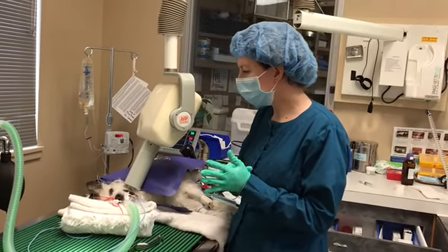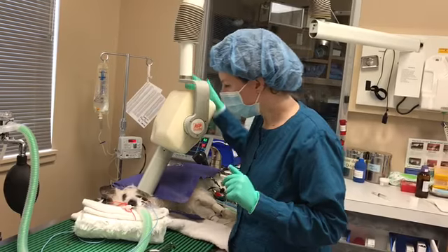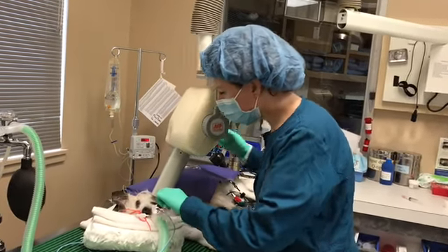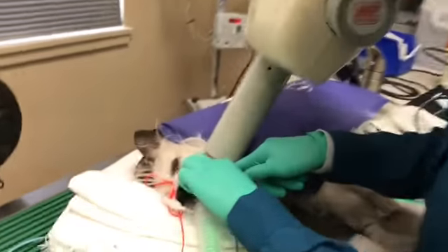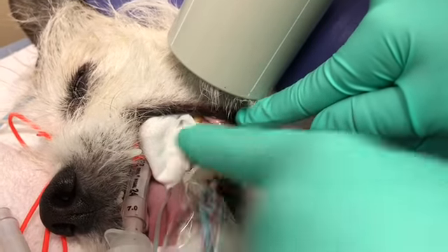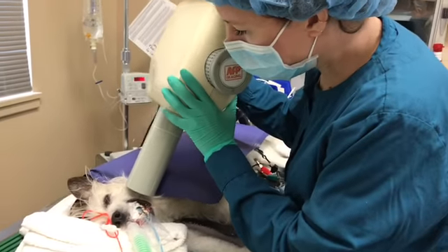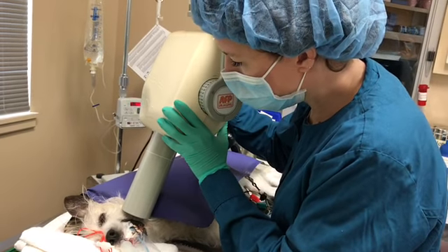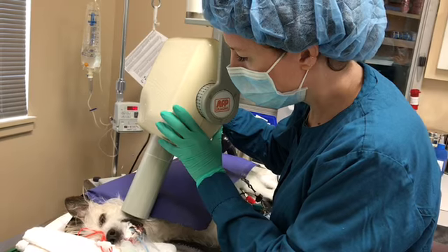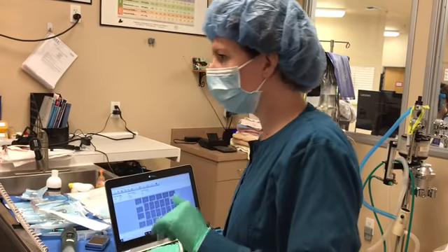Okay, so I'm going to take some dental x-rays. This is our unit, and I've got the sensor here parallel to the mandibular molars. You can kind of see it peeking out there. So I'm using a parallel method. I'm going to press the button, and once it beeps, let go.